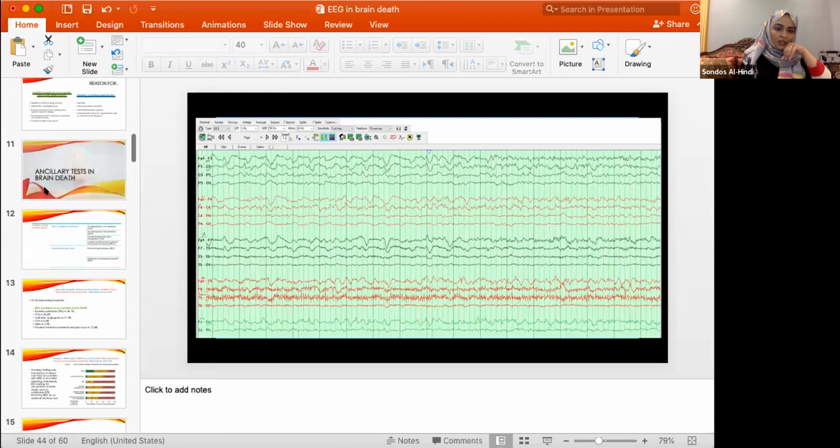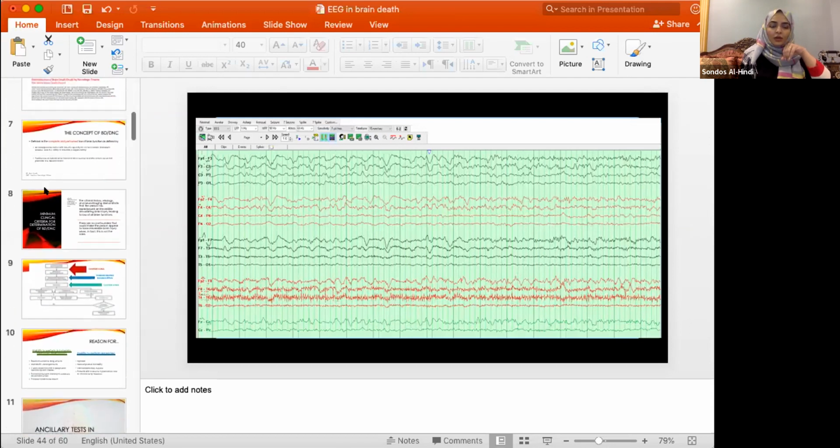There have been reports, as I said, of ongoing EEG activity despite clinical brain death. Most reports are of alpha coma, theta coma, and spindle coma. As I said, these are because of underlying subcortical structures. But none of these case reports have shown any recovery of the patient, in terms of spontaneous breathing, brainstem reflexes, or waking up.